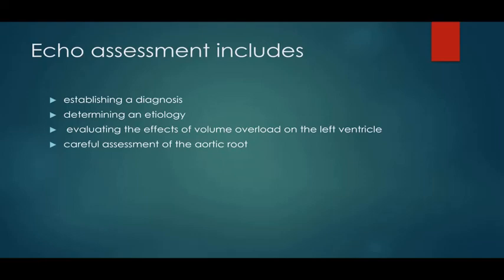The importance of volume overload is that an acute AR will result in an acute volume overload situation in the LV. While if it is a chronic AR, there will be LV dilatation, and the LV will be able to withstand the increased end diastolic volume overload. And also, the careful assessment of the aortic root.